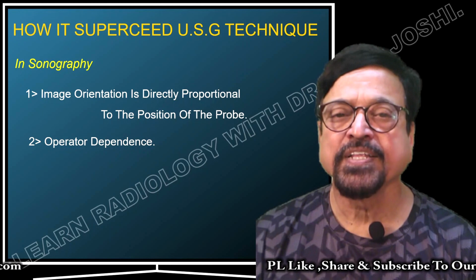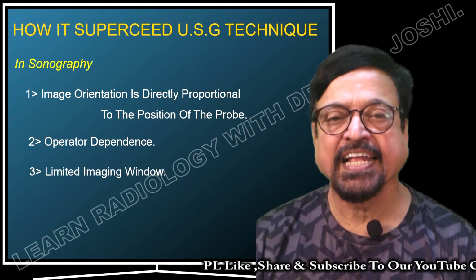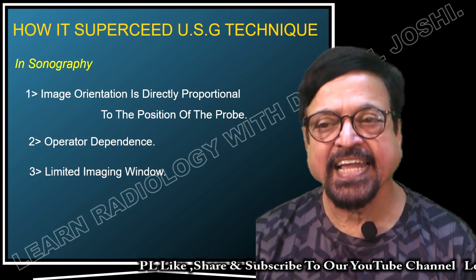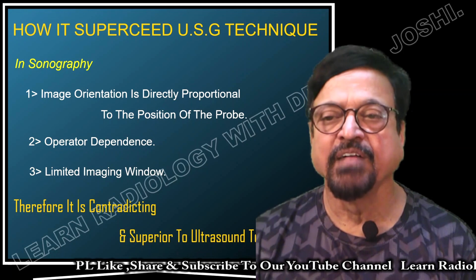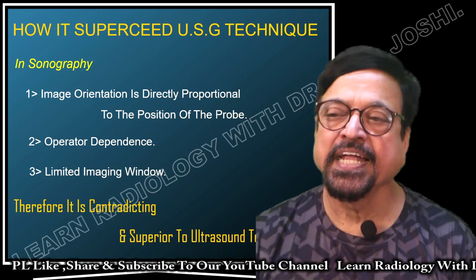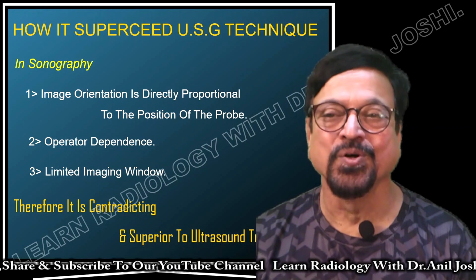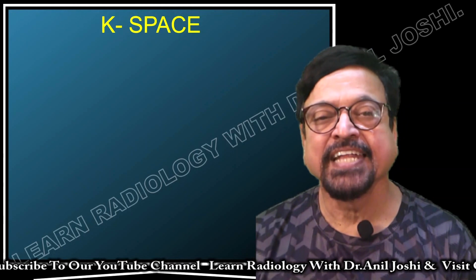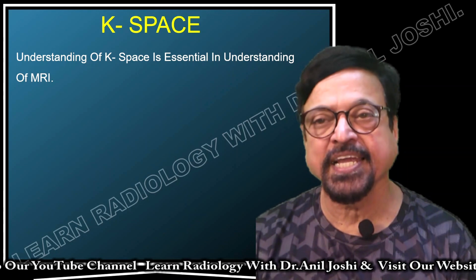Therefore, the advantage is that we can get information in all the axes, though it is operator dependent, and the disadvantage is that it has a limited imaging window. A small amount of data is always imaged at the same time. Therefore, it is contradicting, yet still superior to the ultrasound technique, because we can analyze a larger data set, we can take a large volume of observations at a time, and that is possible only because of K-space.